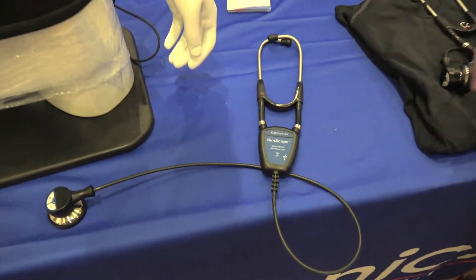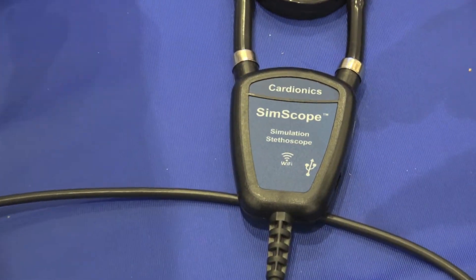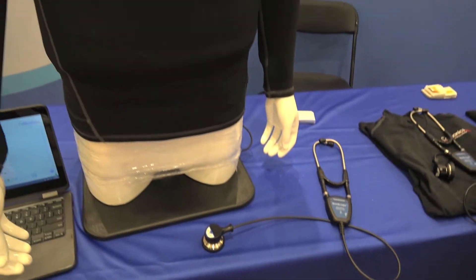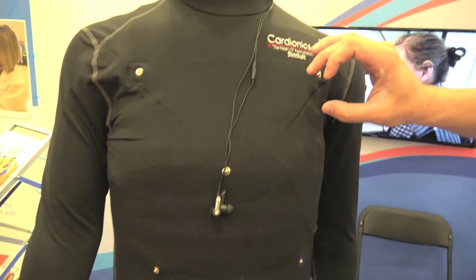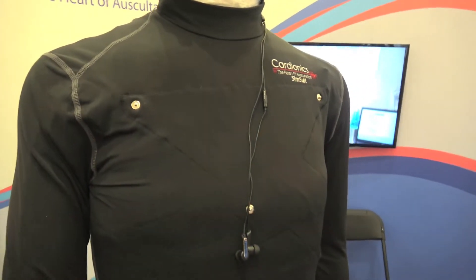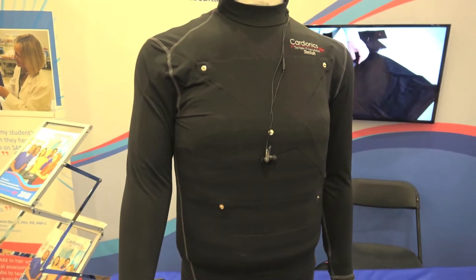The way the SimScope works is you program the sounds through the scope, and then you place the scope over certain areas on the shirt or with patches inside. It's radio frequency technology and it plays the corresponding sound to that location.